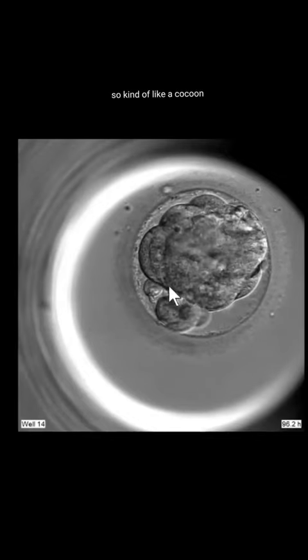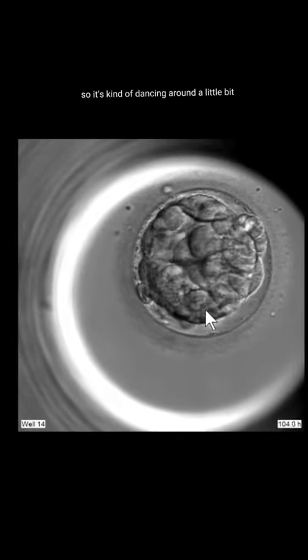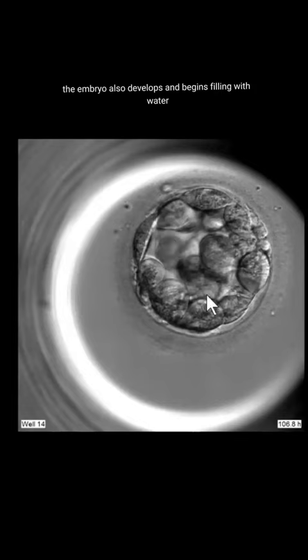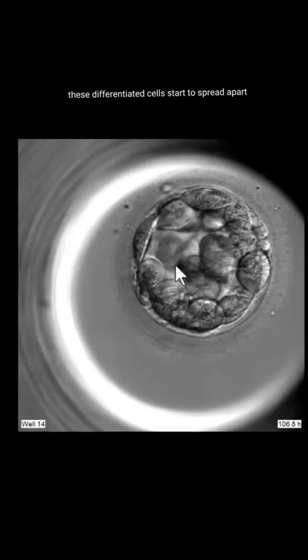So kind of like a cocoon where the cells inside here will now start to differentiate, or change into cells of the inner cell mass or cells of the trophectoderm. So it's kind of dancing around a little bit, doing its thing. Now you can see it expanding. So the blastocoel, which is a fluid-filled sac inside the embryo, also develops and begins filling with water. So these differentiated cells start to spread apart as the blastocoel fills with water, and we'll start to be able to see those individual structures.